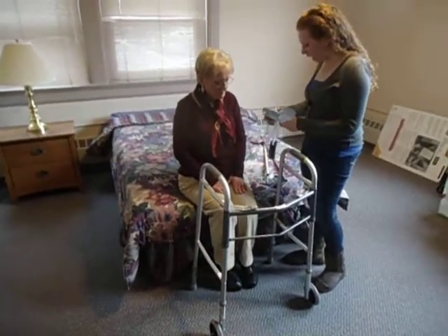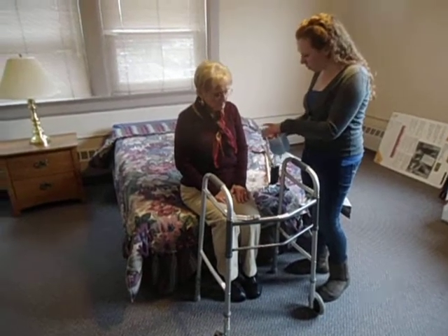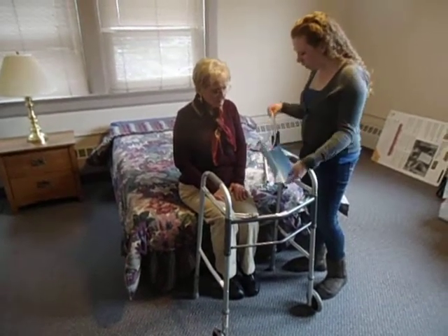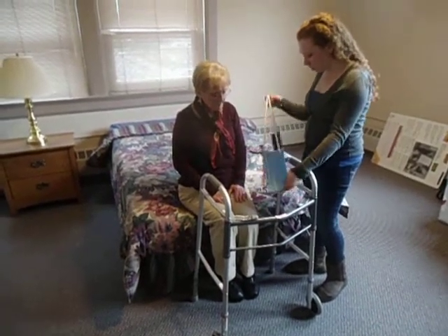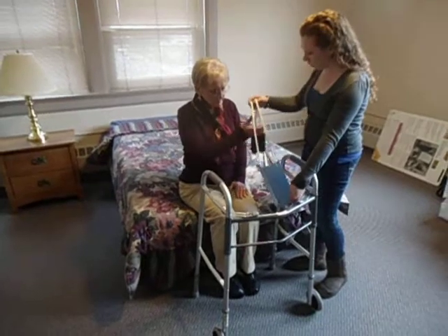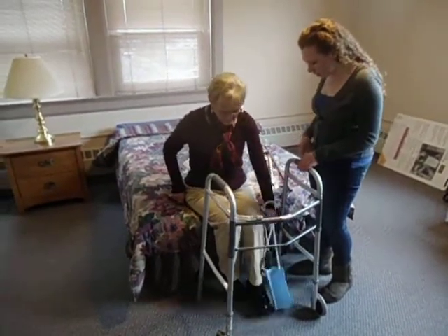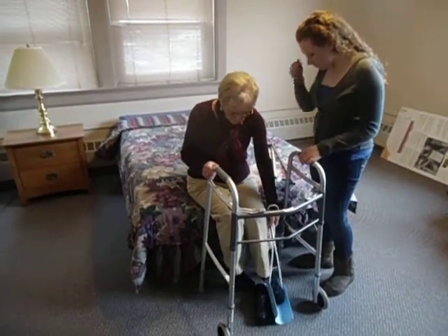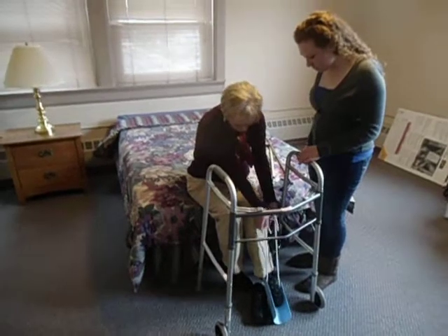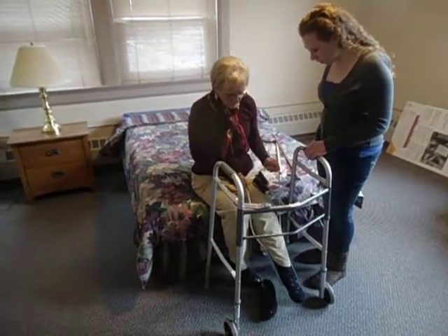So first, this is the sock aid. What you do is you put the sock on here as you would a normal sock on your foot. And you're going to drop it down and put your foot in the hole. So we're going to pretend like there's a sock here just so I can show you how to use it. So, drop it down. Grab a hold of the handles. Put your foot through. Perfect. Okay, great.